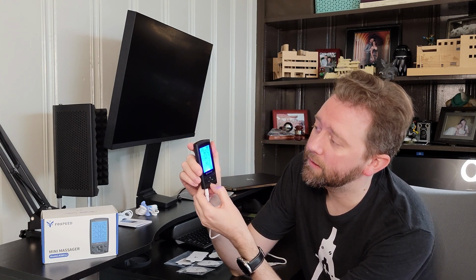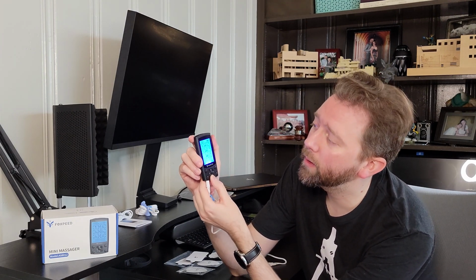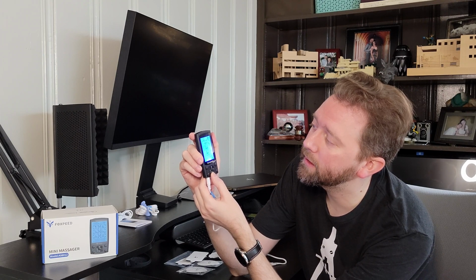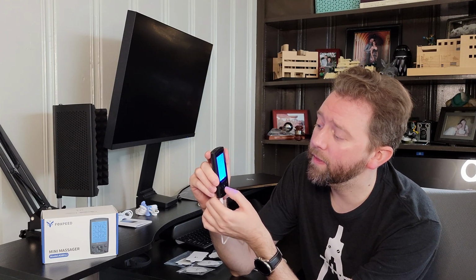You got the T button, which is going to add more to the timer. So it starts off at 20 minutes, but you can go all the way up to 90 minutes, and then it goes back down to 10. But when you turn it on, it was on 20. Then you have the mode button.